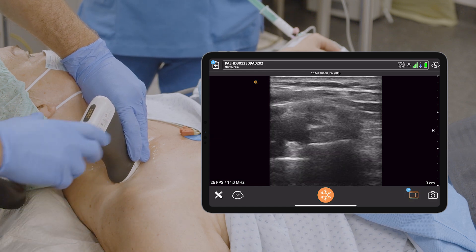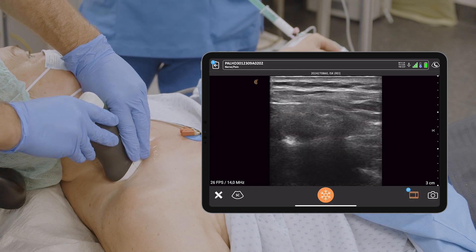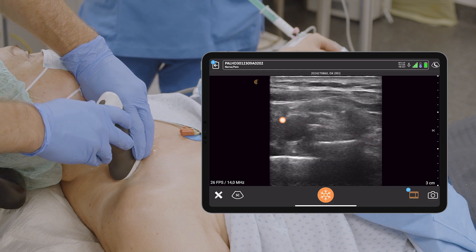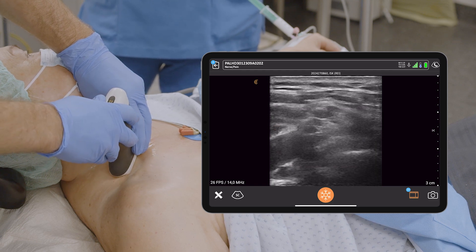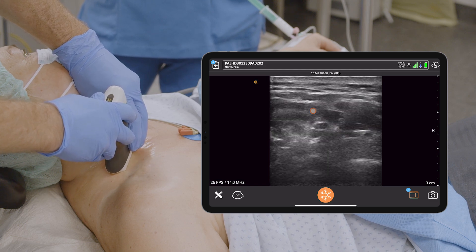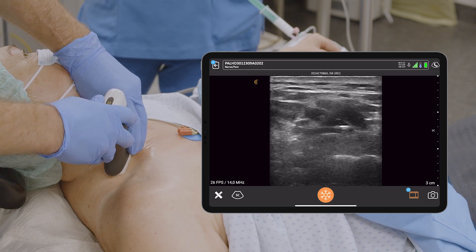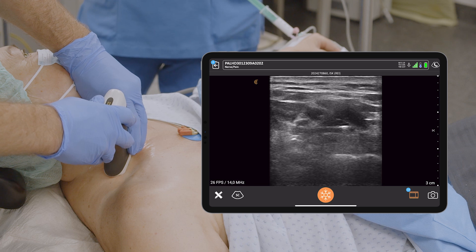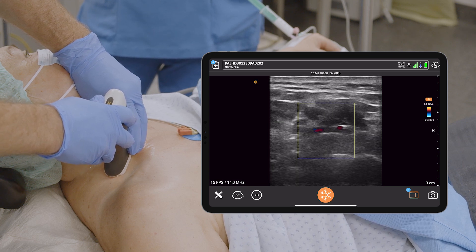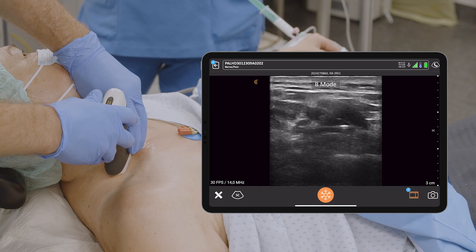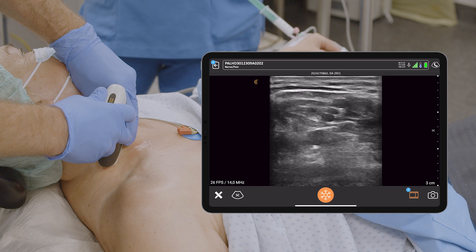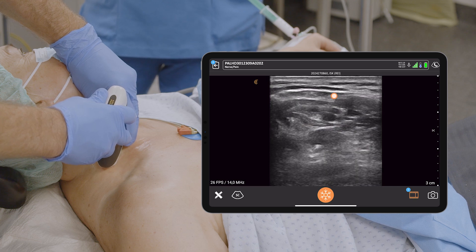On the touchscreen I can also start the video, which is now running. We've got the pleura, the rib, and the subclavian artery. I follow the plexus into the interscalene groove. There are some arteries visible in the middle of the image. 'Color mode' — here it is. 'B-mode.' We're focusing on the superior trunk, which is already in view.